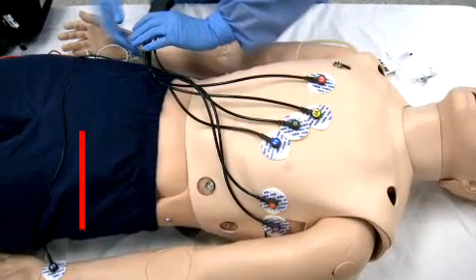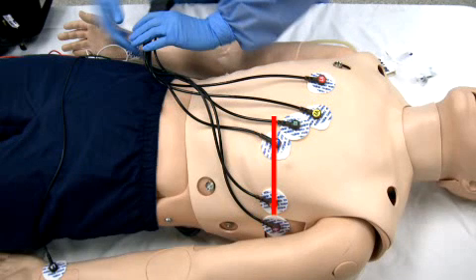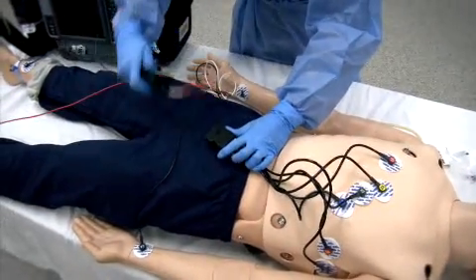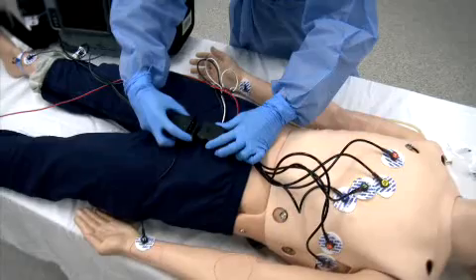Leads V4 through V6 should form a straight line from the 5th intercostal space to the mid-axillary line. Connect the precordial leads to the limb leads at the connector point.